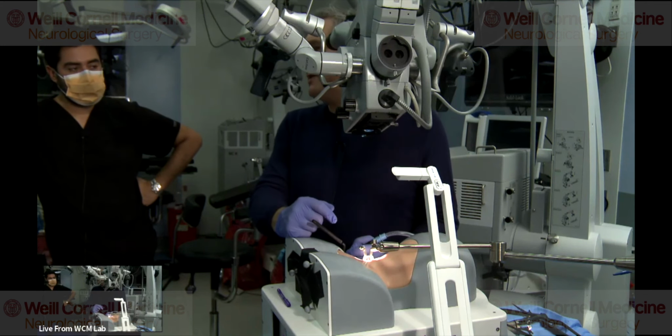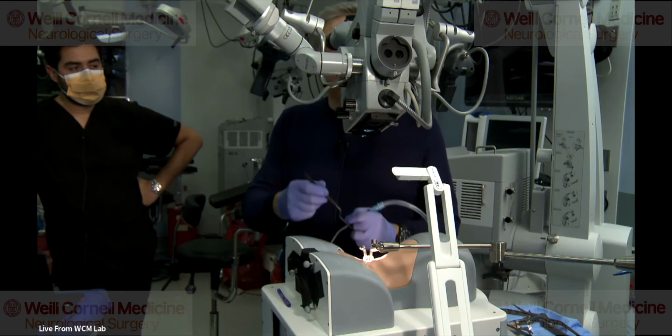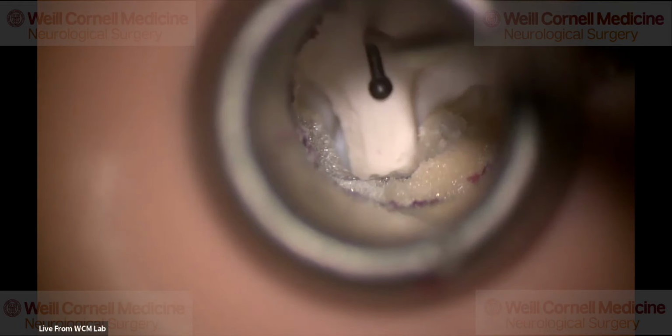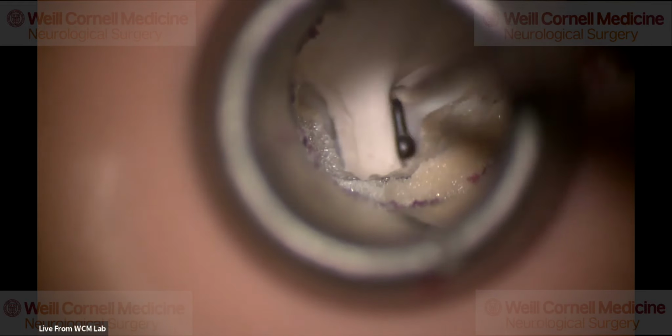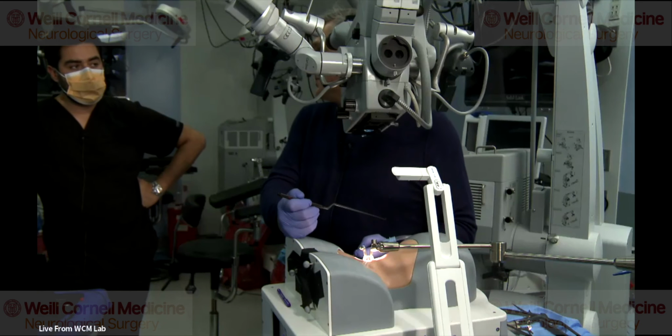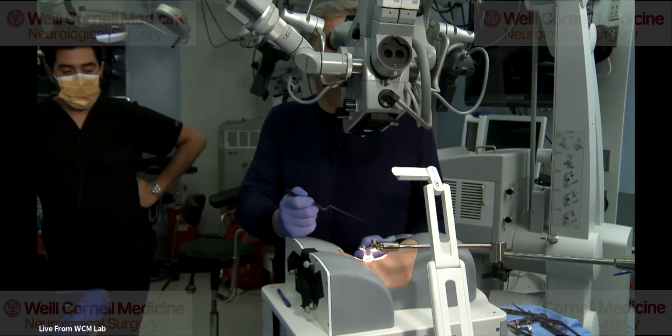If you have a problem here with weakness post-op, I think it's more manipulation during the surgery. And usually what happens here is that when you go lateral, the Kerrison that you use is too big and you push on that nerve. That's why I only use a 1 millimeter Kerrison. Yeah, I agree.